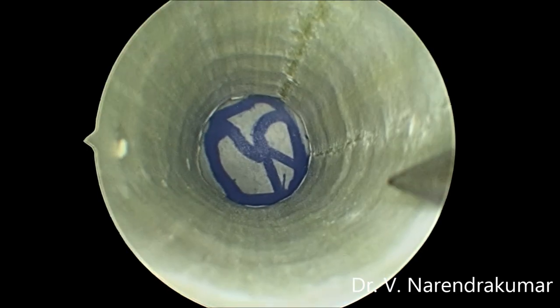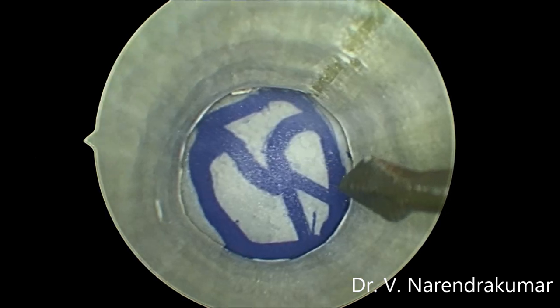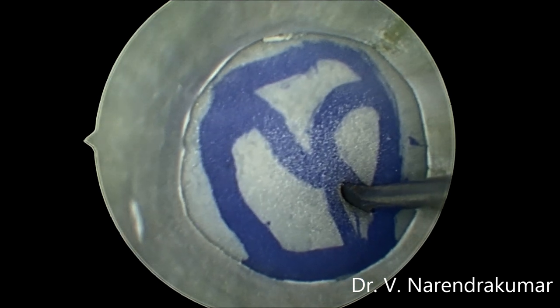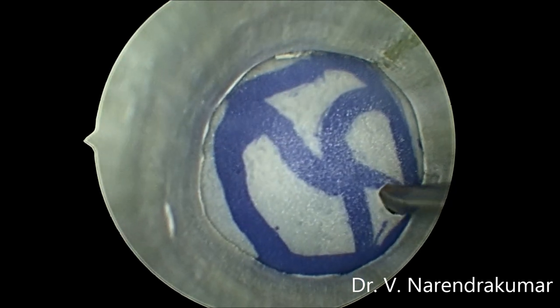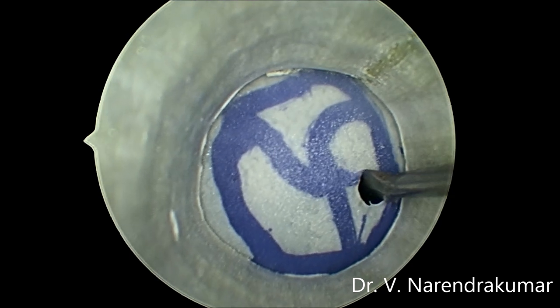The first exercise is placing a grommet. This is a myringotomy knife — take it inside. I am making an incision in the antero-inferior quadrant of the tympanic membrane. Feel how the glove is exactly similar to the tympanic membrane — it is very tensed.